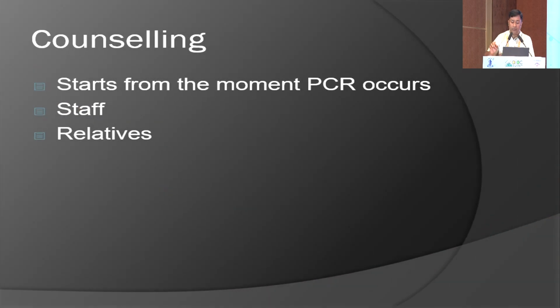Counseling starts from the moment the PCR occurs. The patient comes to know that something has happened if the OT atmosphere changes. So you need to be very well versed with such situations. Your staff has to be very well versed. आपके इशारे से उसको समझ में आ जाना चाहिए कि हाँ कटर निकालना है और कटर रेडी होना चाहिए. ये नहीं कि कटर कहीं रखा हुआ था और वो मिल नहीं रहा है. So staff has to be well versed.